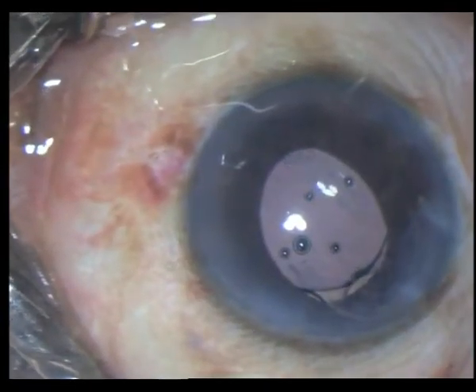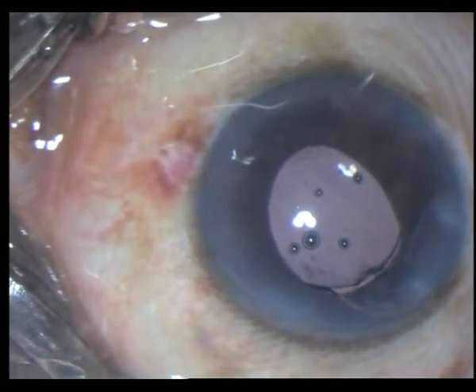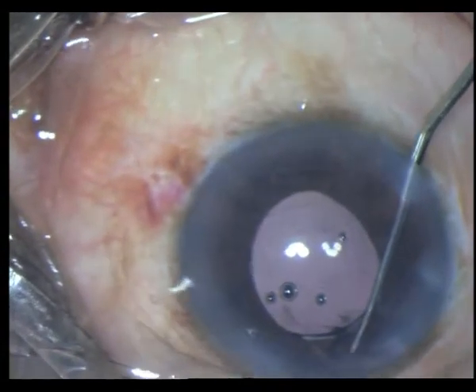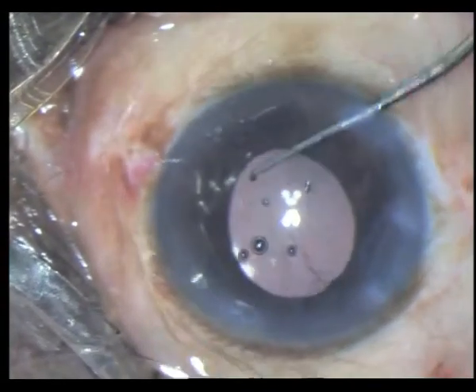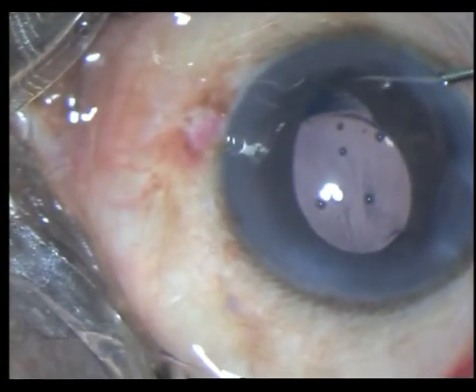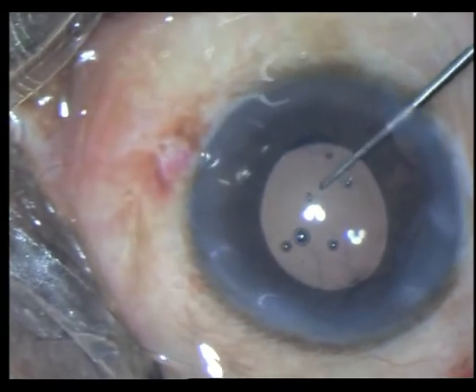The better option obviously would be a 3-piece hydrophobic IOL in the sulcus. I ensure the trailing haptic goes into the sulcus as well. Most of the time I try and capture the optic within the rhexis, although here you cannot see it under the pupil.